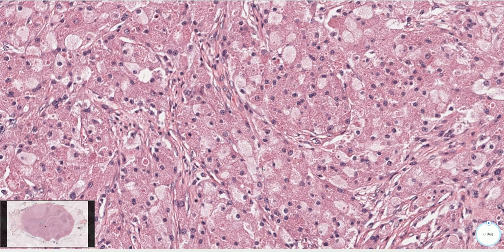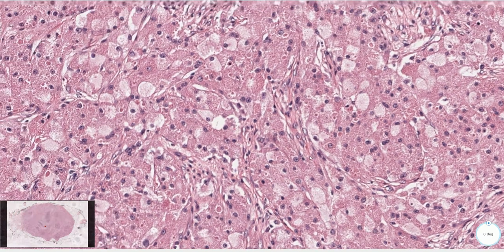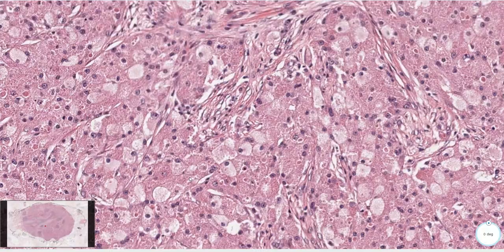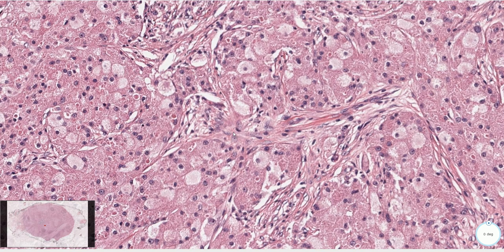Some histological criteria for distinction between benign and malignant granular cell tumors have been proposed and they include necrosis, spindle cell morphology which we see partly here, and vesicular nuclei with prominent nucleoli as seen here.